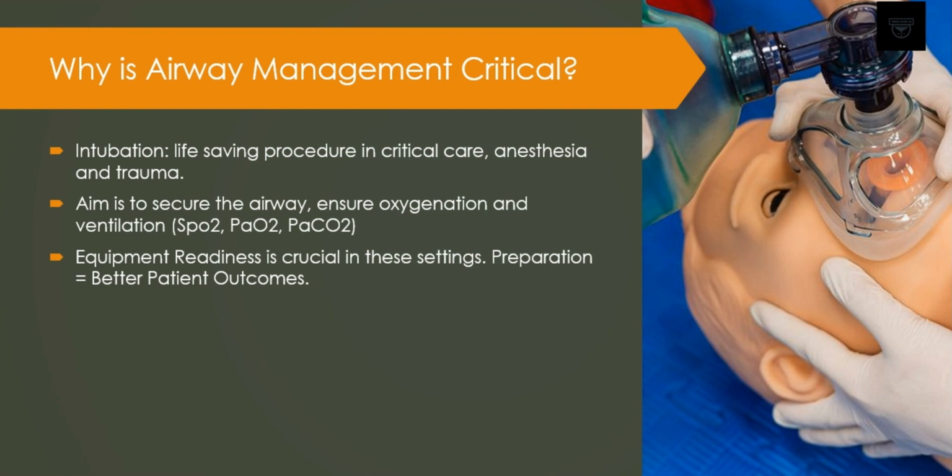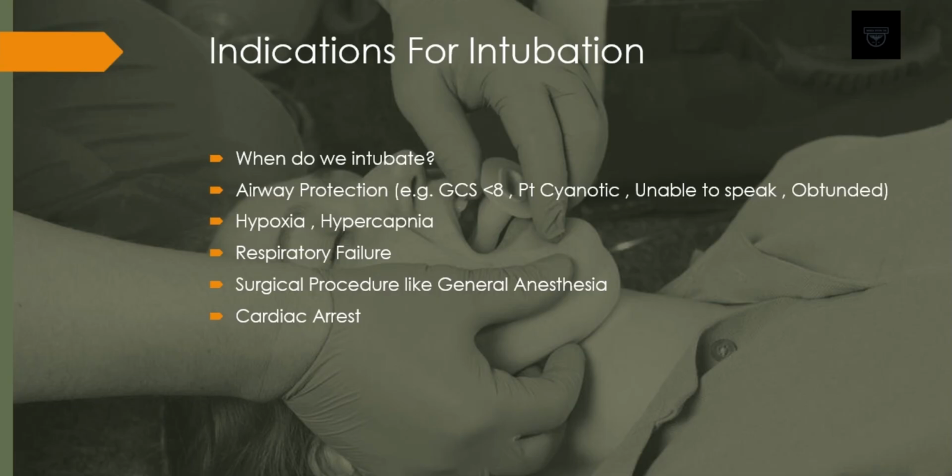So the equipment readiness is crucial in intubations. In these settings, whether you're in the ED or you're doing a general surgery, whatever it is, you have to be prepared. So preparation equals better patient outcomes.